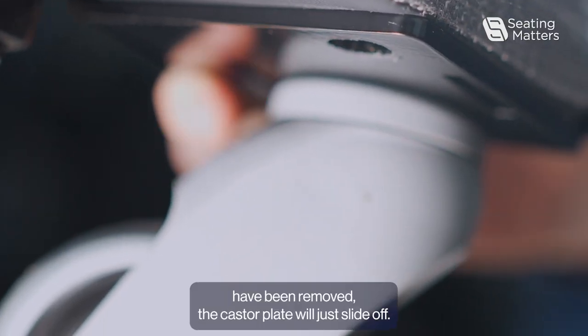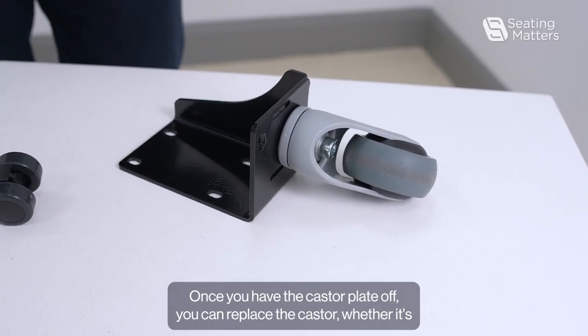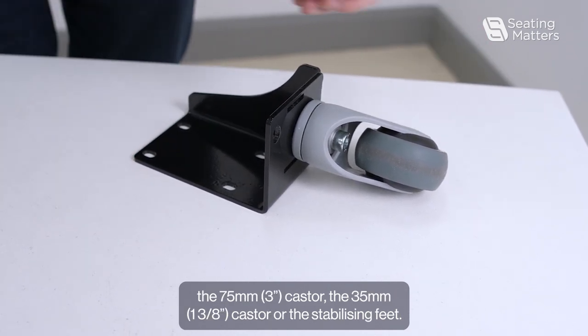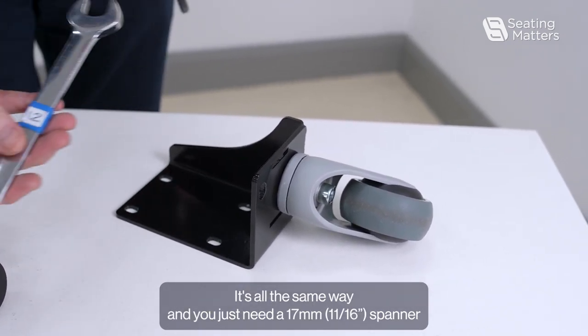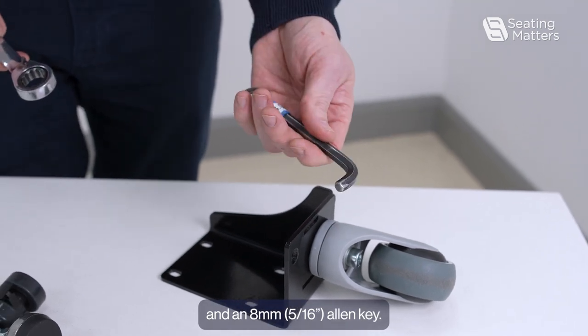Once the five bolts have been removed, the caster plate will just slide off. Once you have the caster plate off, you can replace the caster — whether it's the 75mm caster, the 35mm caster, or the stabilizing feet — it's all the same way, and you just need a 17mm spanner and an 8mm Allen key.